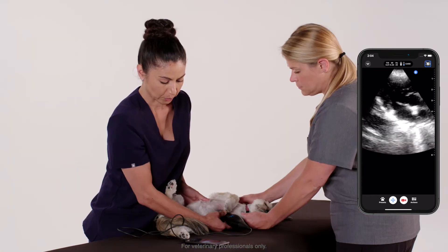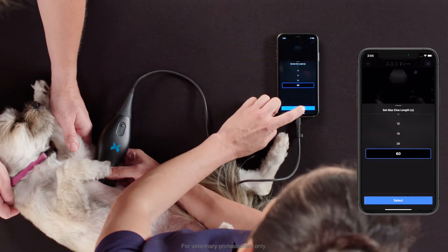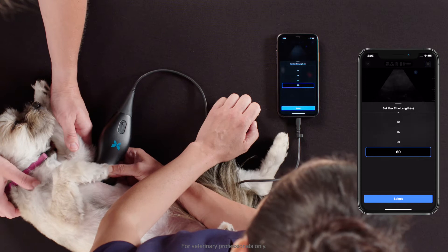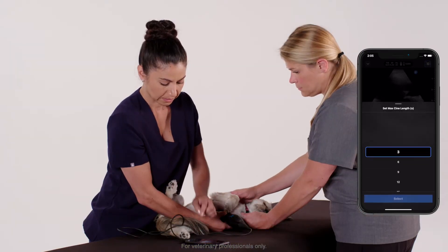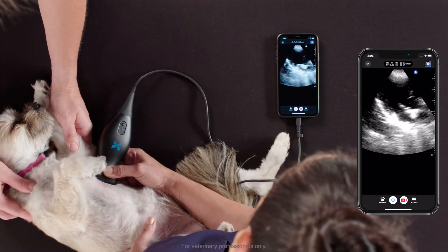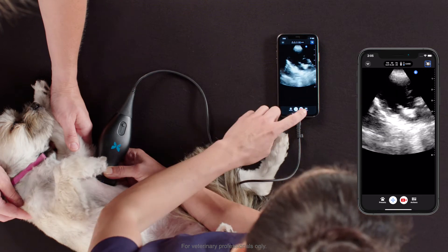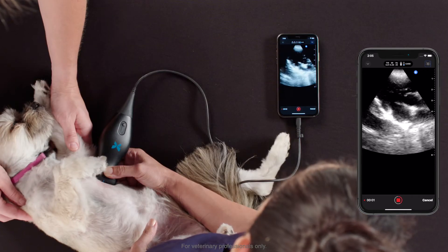I can also set the prospective loop length by pressing and holding the red camera. A pop-up will appear and I can scroll through the seconds, tap select, and you'll notice my new max length in seconds. If I take the recording, only three seconds will capture.